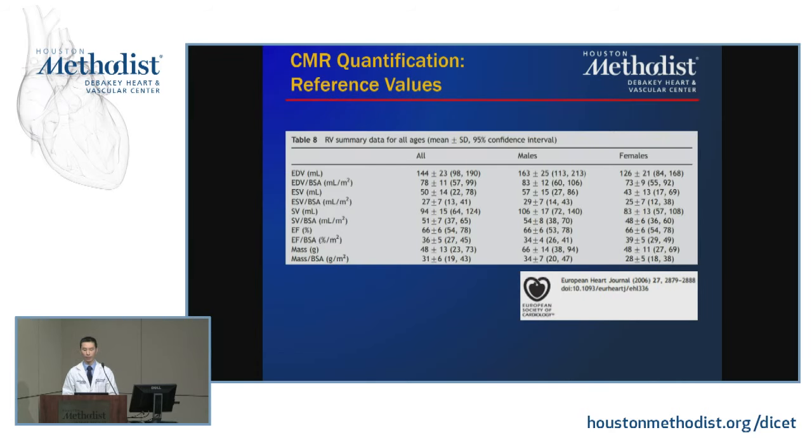And Dr. Nagueh did mention reference values. If we take all comers, the 95% confidence intervals for RVEF is actually much higher. It's between 54 and 78%, as can be seen here. And it's actually not too different between men and women. But there is a trend that's been noticed in various epidemiologic studies.